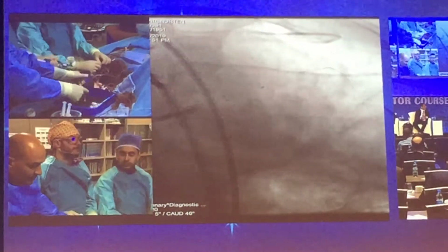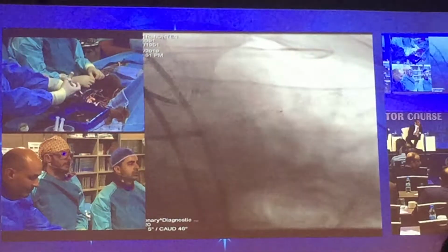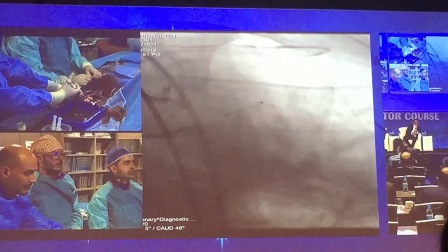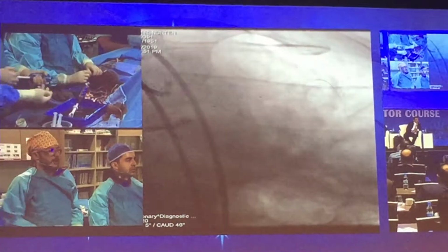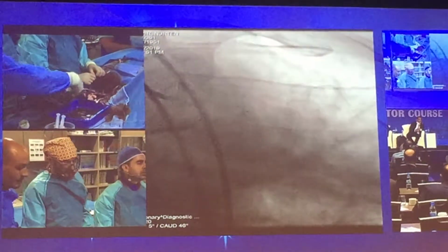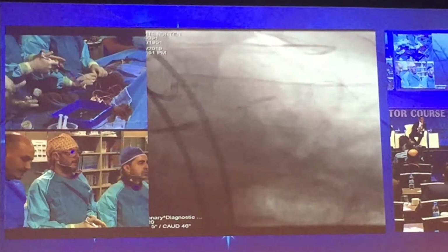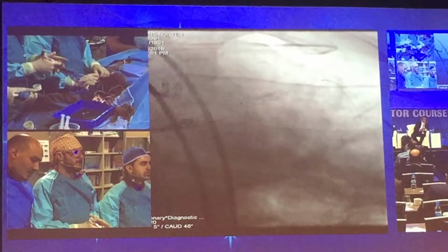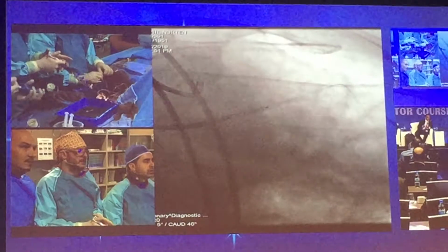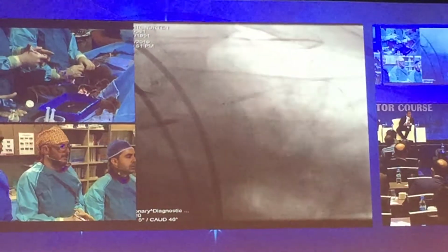Do you offer an imaging for this in terms of determination of the vessel size? I think IVUS is an important tool here because we can search for the cause of the restenosis, whether it is under expansion or there is a malapposition of the stents, and we can answer the stent failure, also to optimize the new stent for the size and good apposition. If there is any calcification hindering the expansion of the stent, we can see with the IVUS. So I think IVUS is mandatory here to assess before implanting the stent and after implantation.